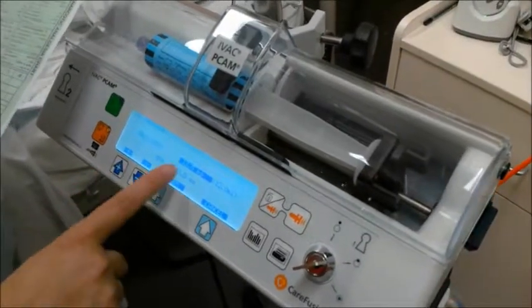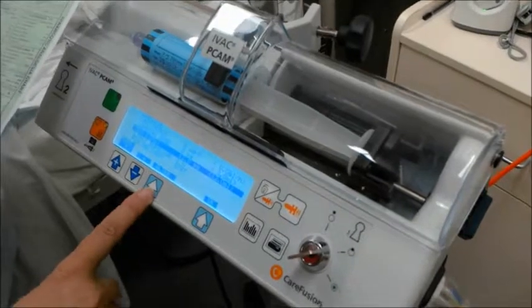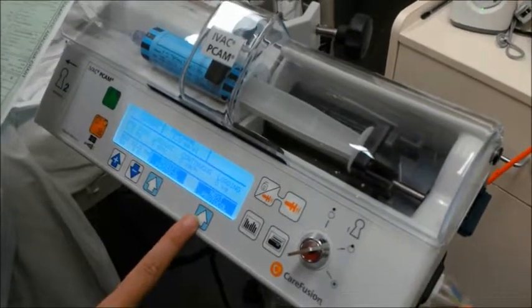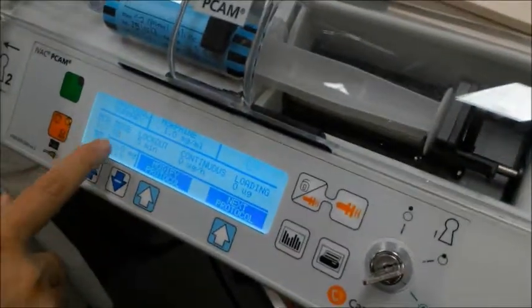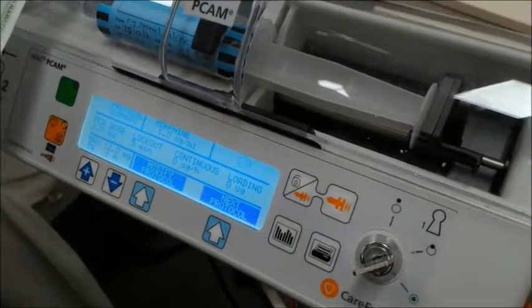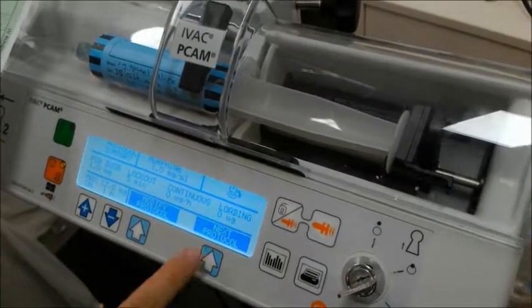Okay, 12 mg, confirm. Protocol summary: morphine 1.0 mg dose, lockout 5 minutes, maximum dose of 12 mg. Okay.